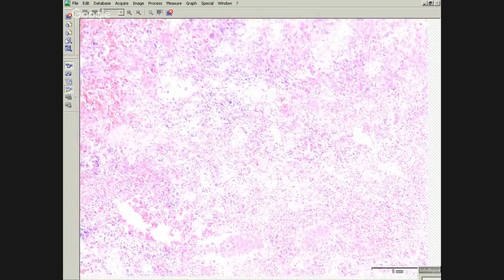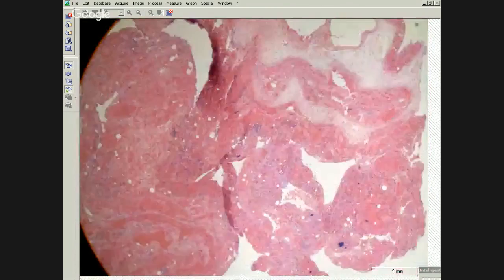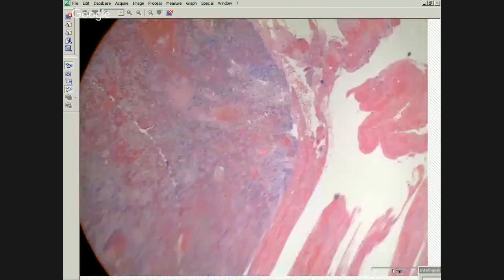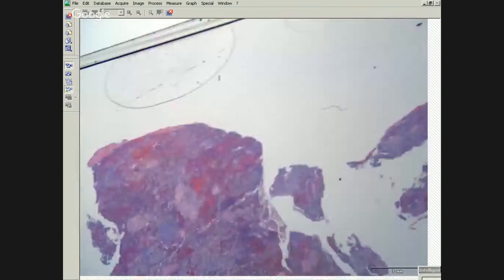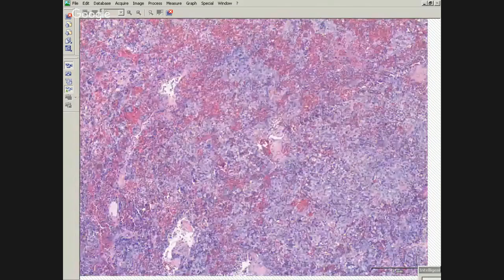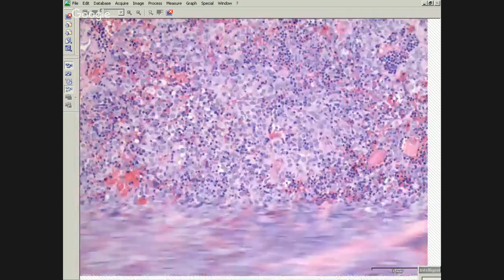It's not like LCH, because of the eosinophils. So we are not seeing eosinophils, right? Right, there are no eosinophils. I thought I had a slide, but this one doesn't have it. This was also very fibrotic, so I grabbed a slide that was not showing that. But this did have some big fibrous bands in it.